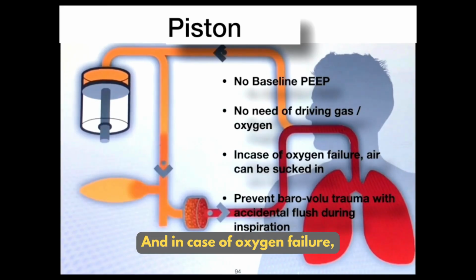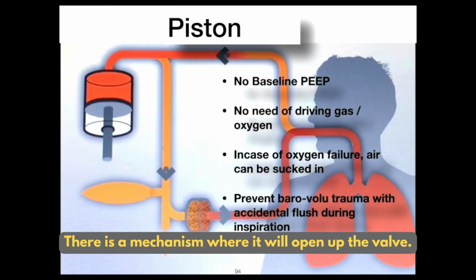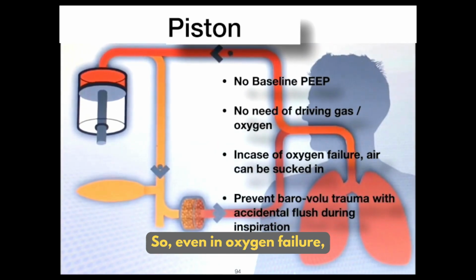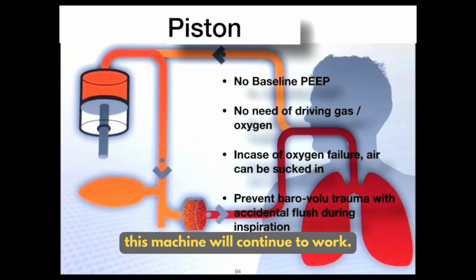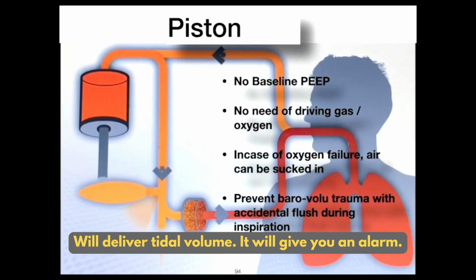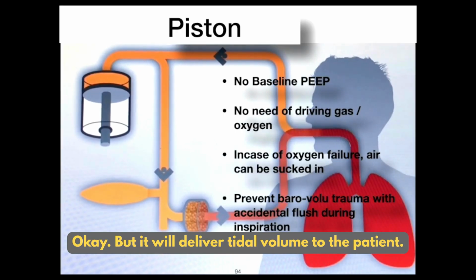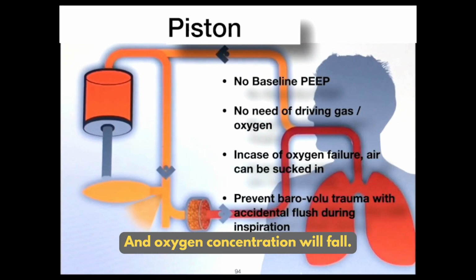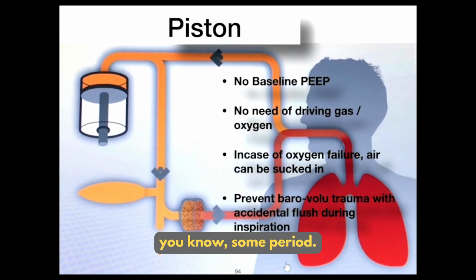And in case of oxygen failure, suppose there is no oxygen, there is a mechanism where it will open up the valve and air can be sucked in. So even in oxygen failure, this machine will continue to work and will deliver tidal volume. It will give you an alarm, but it will deliver tidal volume to the patient, and oxygen concentration will fall, but it will deliver for some period.